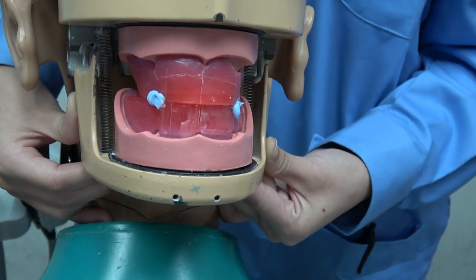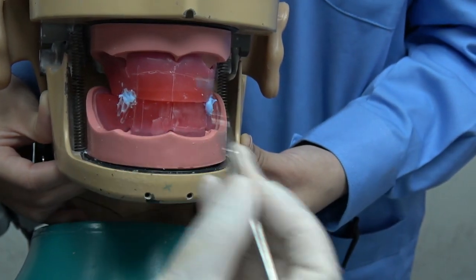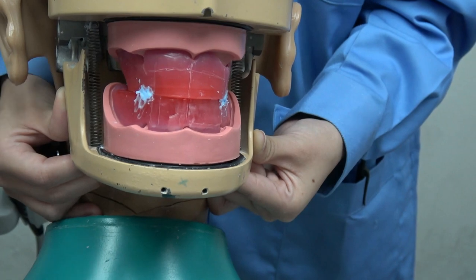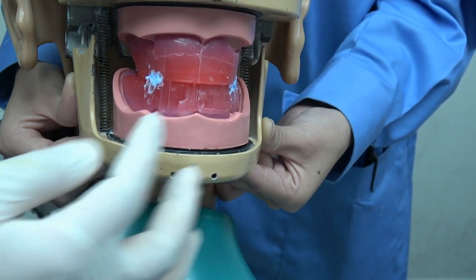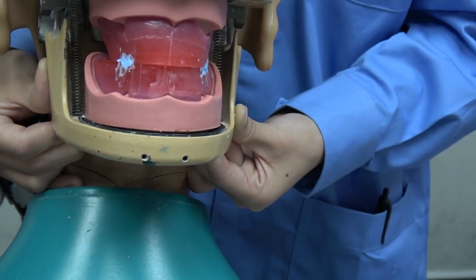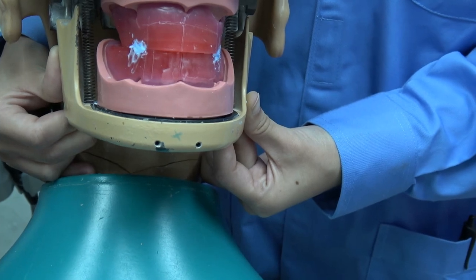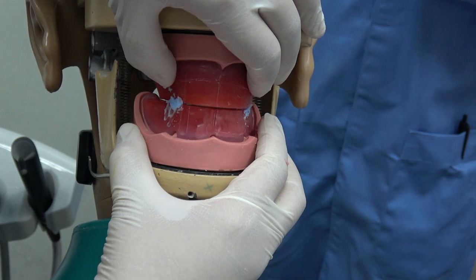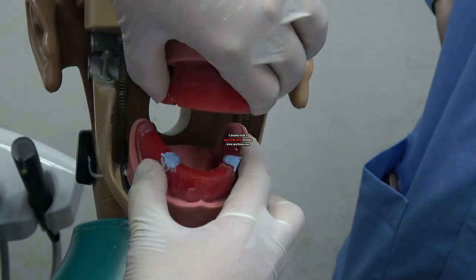If there is excess before it sets, trim off. Wait until it sets. You should hold the phantom head until it sets. Do not move. If you move, the lines won't coincide with each other and you have to redo again. For the redo step you have to use zinc oxide. I will show you how to use it. Once it sets, you can remove. Make sure it can bite again.